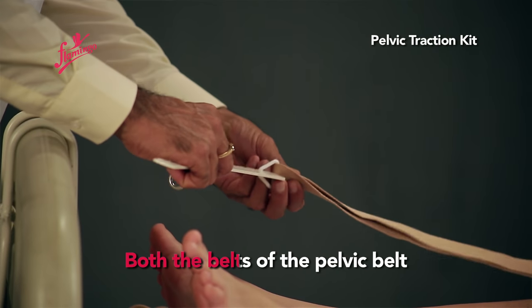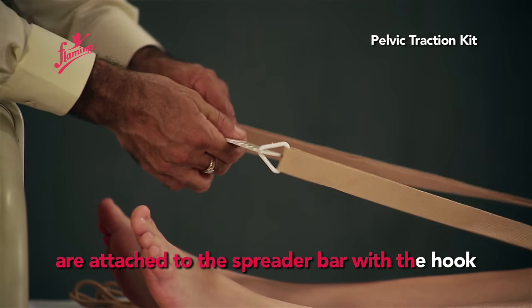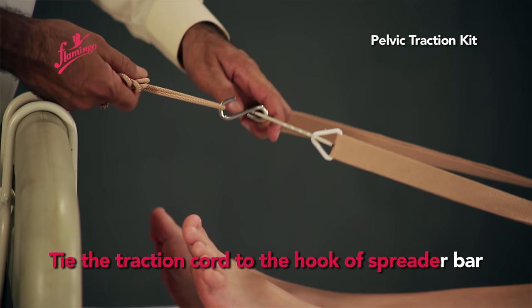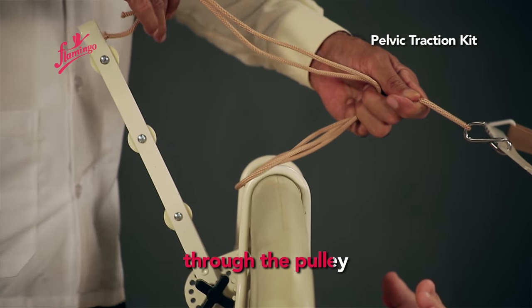Both belts of the Pelvic Belt are attached to the spreader bar with the hook. Tie the traction cord to the hook of the spreader bar and pass the other end of the traction cord through the pulley.